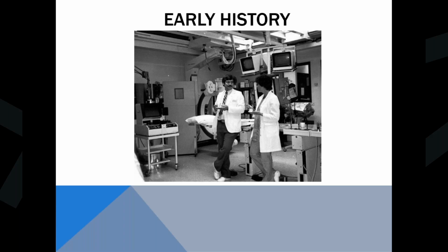There'd be two big spools, and I'd have to spool up the film for it. And then the doc had a foot pedal that he would stomp on, and then it would run it through, and then he could back it up and run it through. And then when he wanted to look at the next film, then I'd have to come in, change it for him, spool it up, and then he could look at his thing. And that would have been early to mid 2000s when I was still doing that. Now, I don't think any cardiologist is still doing his job that would have still used that stuff. But back then, they were still insisting to see their old cine films from back in the 80s and 90s.